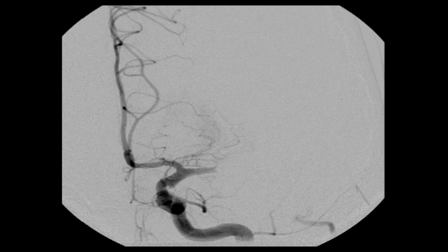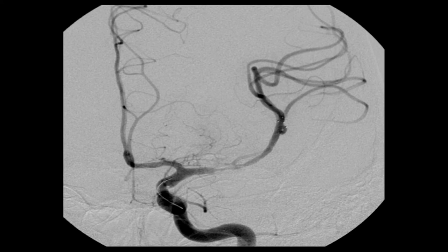And here's an example right here. This is the internal carotid artery coming up, middle cerebral artery occlusion. Here's the stick, so that's the wire. The Solitaire device starts here and goes all the way to these tines right there. And you can't see it because it's not radio opaque, but when you deploy it, it tends to push the clot out to the periphery, and you actually have an opening where the brain gets a drink of water, is what we say, because then you're actually perfusing the brain. Not all of it, because there are other branches that are being blocked by this, but some of it.